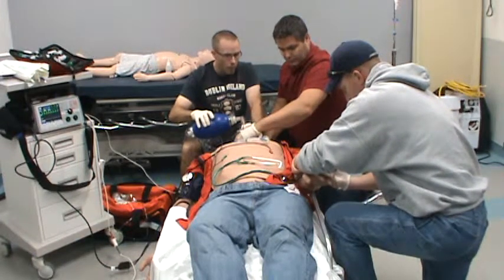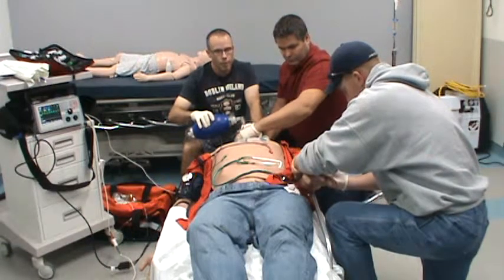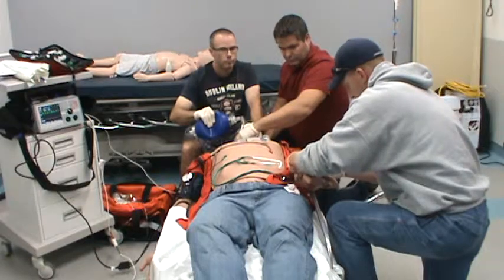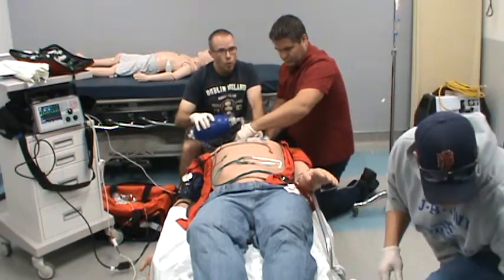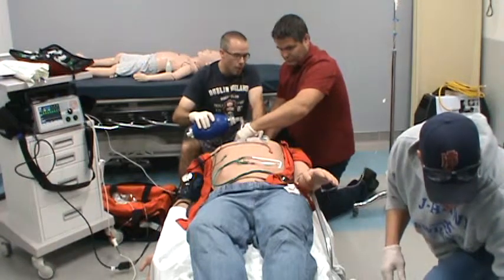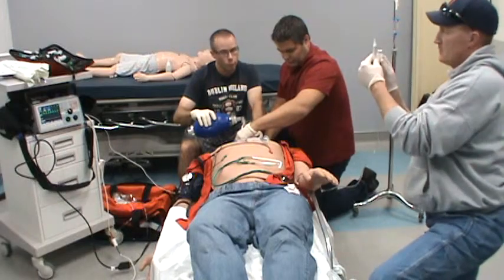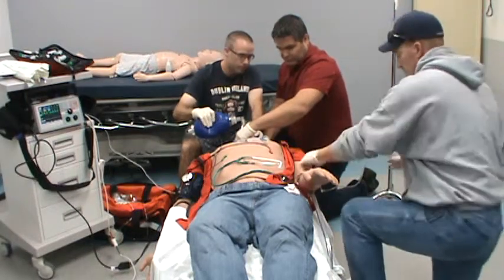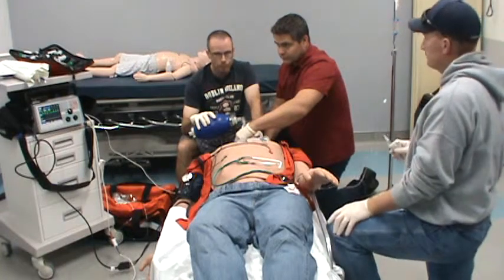Again, we've been pre-oxygenating for a couple minutes now, which is good. We should be flushing out the majority of the nitrogen. Okay, ketamine's in. That's at 1351. In about 45 seconds, I'll have you give the succinylcholine. I'll give you the mark. Bagging is still going good.